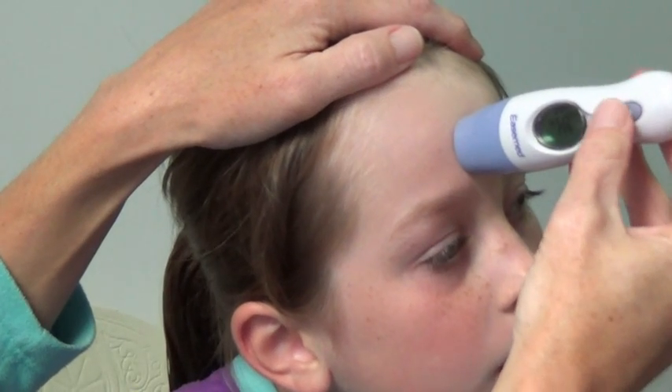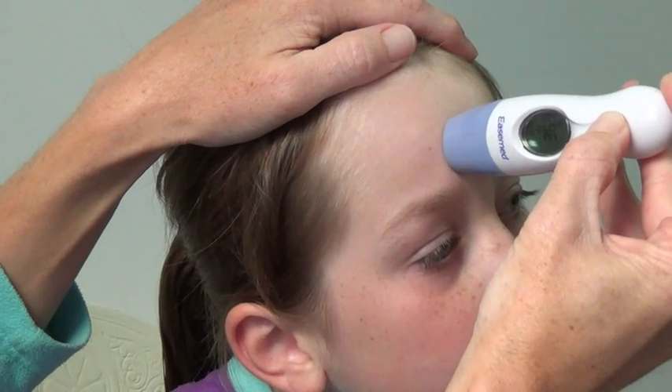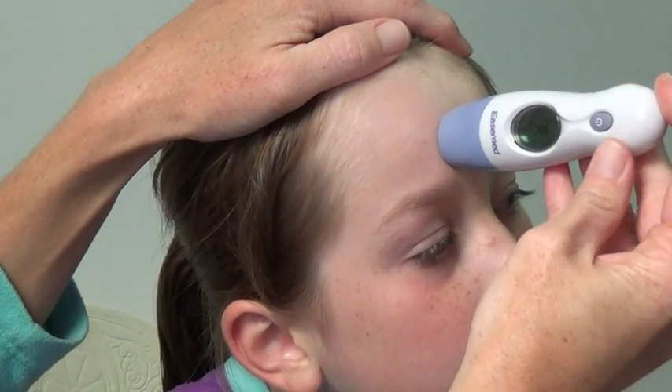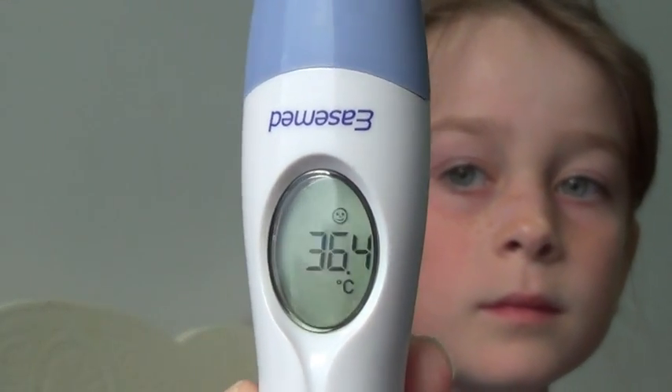So here we go — pressing it down, keeping it down. And I think that's enough. Depress it. There we go — one long beep. And there your child's measurement has been taken.